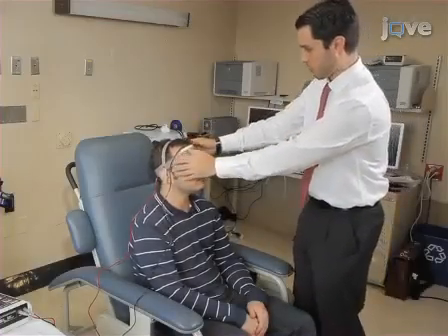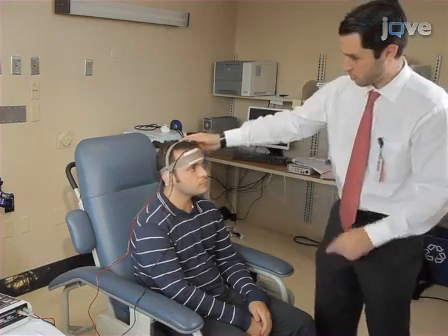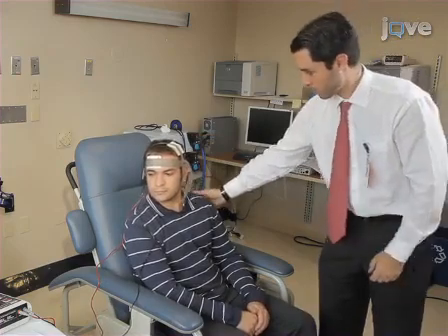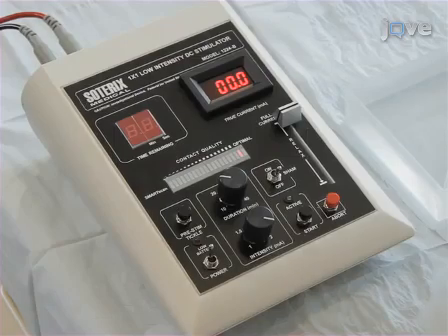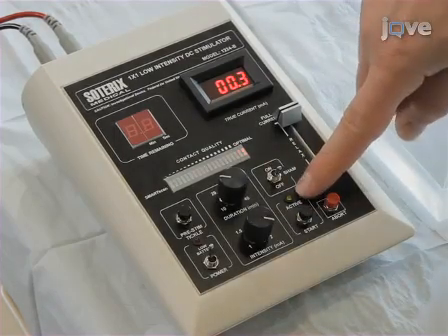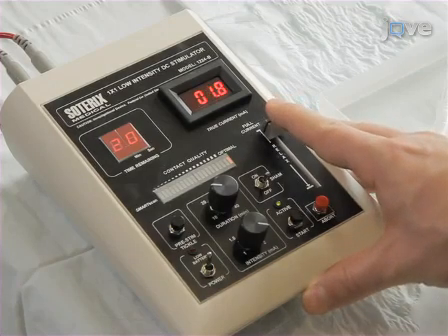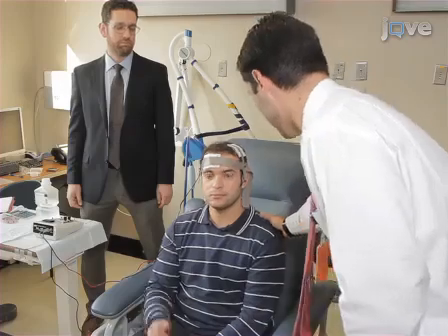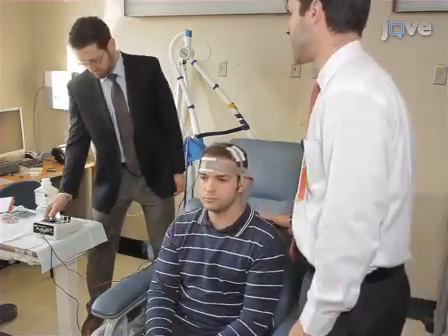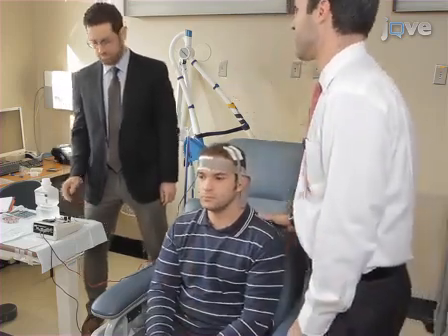Before beginning the experiment, assure that the subject is comfortable and instruct him or her to remain relaxed and awake during TDCS. This will avoid interference, since intensive cognitive effort unrelated to the target area, as well as activation of the motor cortex via prolonged muscle contraction, has been shown to modify the effects of TDCS. Initiate the TDCS by pressing the Start button. To reduce any adverse effects, start by ramping up the current flow. At the beginning of stimulation, the majority of subjects will perceive a slight itching sensation which then fades in most cases. Some subjects may experience discomfort; in such cases, the current may be decreased by 50% temporarily, then gradually increased back up to the desired level.